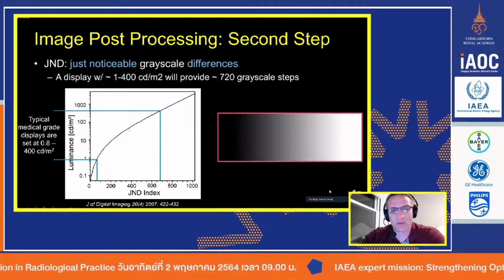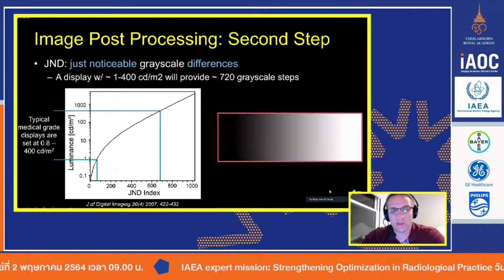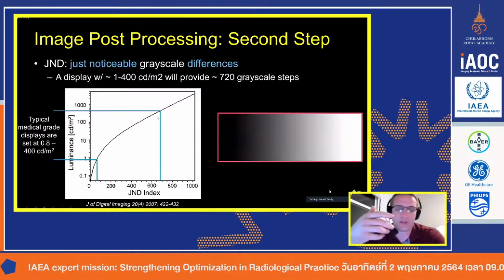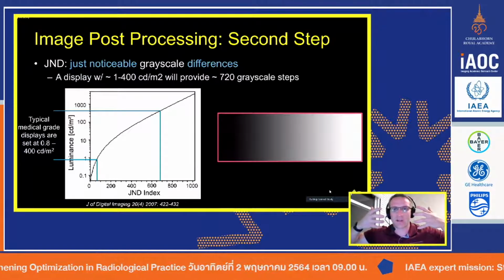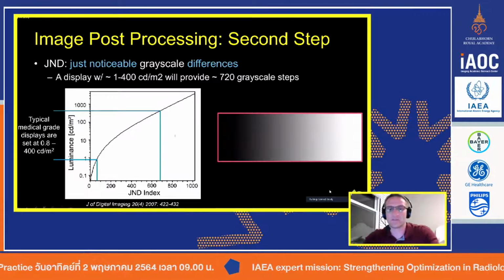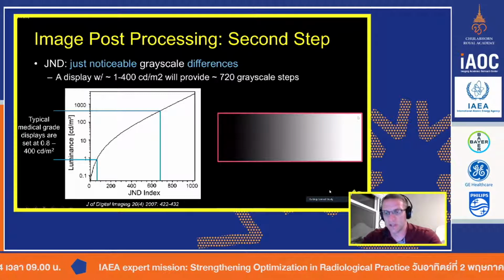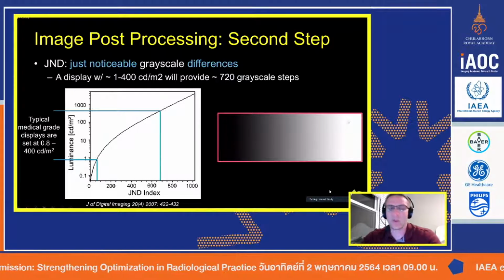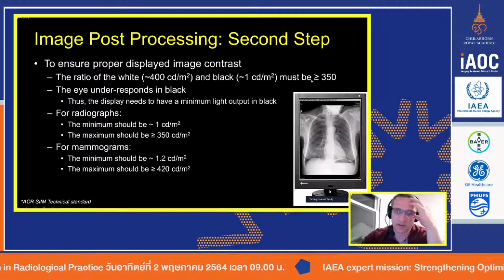So what we do is we will calibrate all of the monitors in the reading room to usually have somewhere between a luminance output of about 1 to 400. And this is something that usually medical physicists do. And so luminance is a measure of the light coming out of your monitor and striking your eyes. And so a very low number, such as 1, is going to be represented as black, or basically zero signal. And a high number, typically 400, is going to be somewhere in the white value. And so we turn on these monitors to usually be about 1 and 400. So it ranges between 1 and 400.